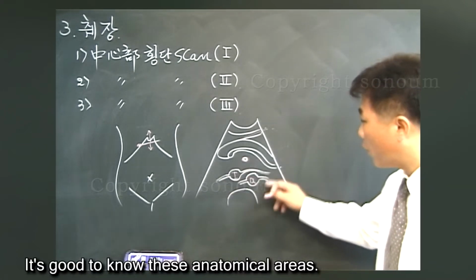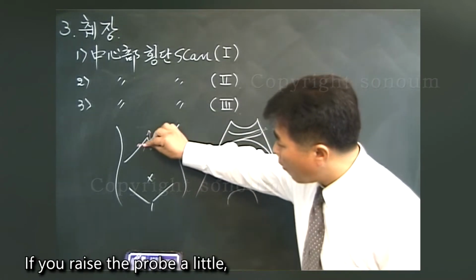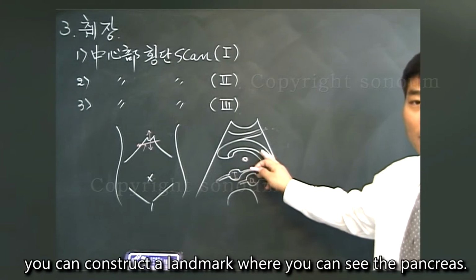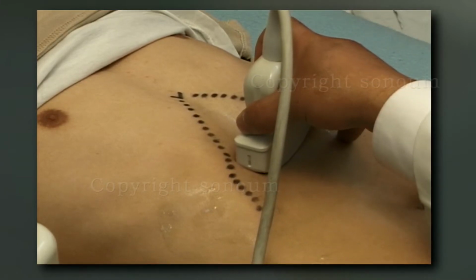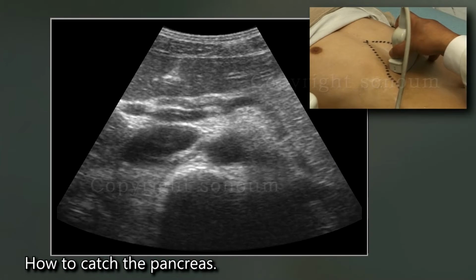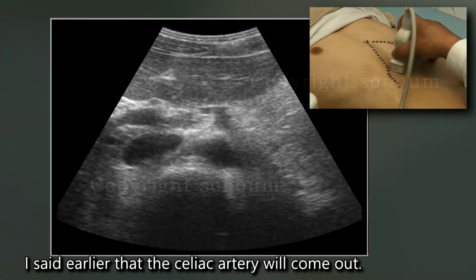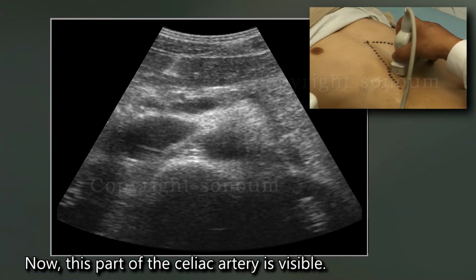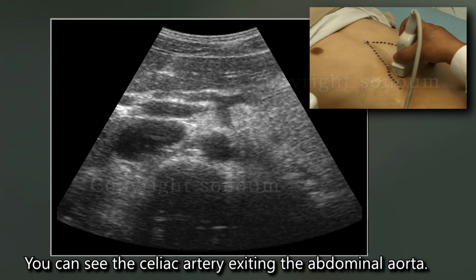It's good to know these anatomical areas. When this picture comes out, if you raise the probe a little, you can construct a landmark where you can see the pancreas. How to catch the pancreas? If you give a slight angle to the head, as I said earlier, the celiac artery will come out. Now this part of the celiac artery is visible. You can see the celiac artery exiting the abdominal aorta.